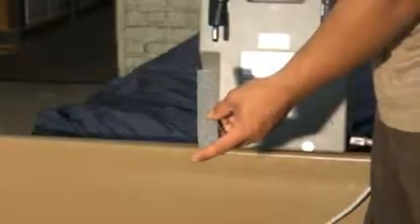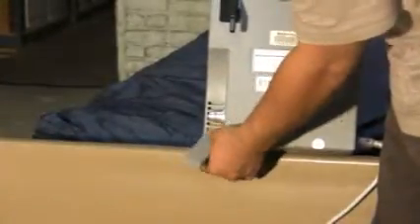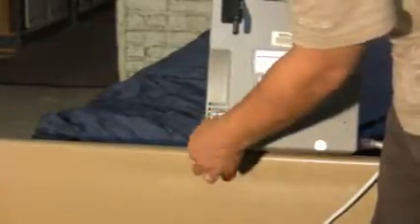Rinse out your air filter under warm water. Squeeze out any dirt and debris. Get a dry towel and squeeze out any moisture and water droplets in that dry towel. You may place the filter back when you have dried the filter. Moist is okay, but do not place the filter back wet.